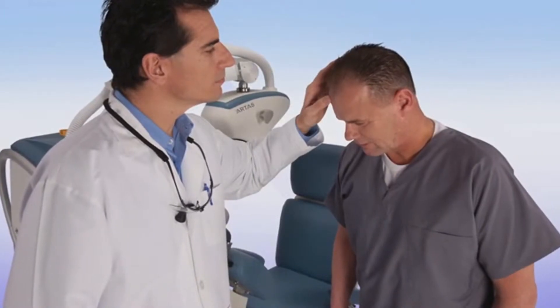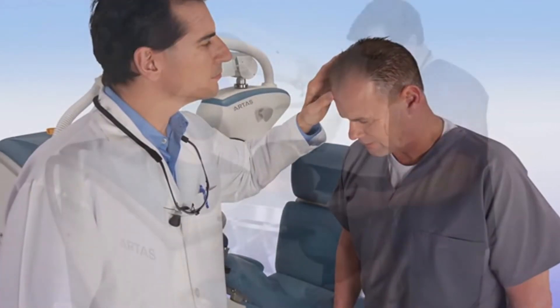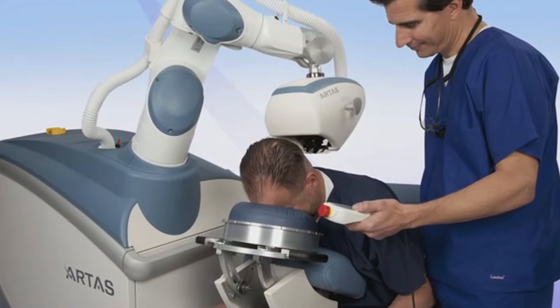Prior to the procedure, you and your doctor will discuss and determine the best treatment plan. You'll then be seated comfortably in the ARTAS chair, where your hair will be trimmed so the system can digitize each follicular unit.